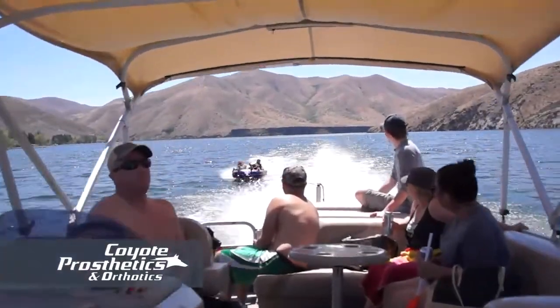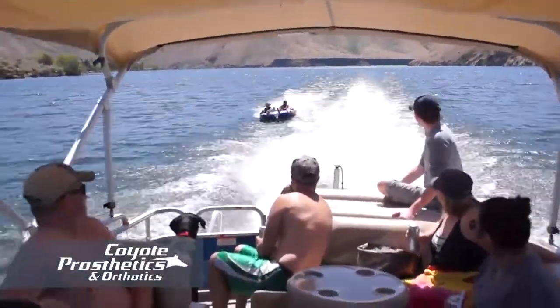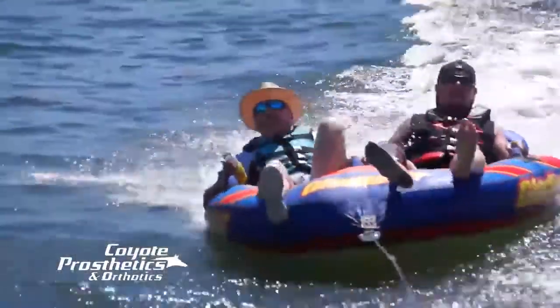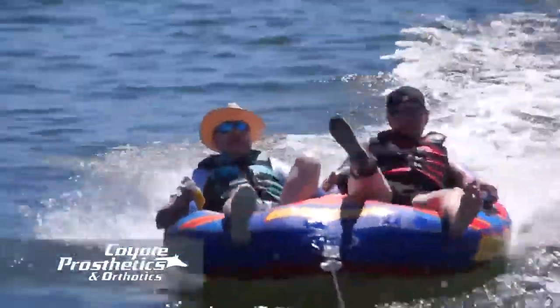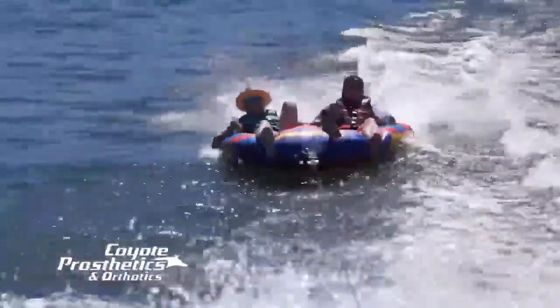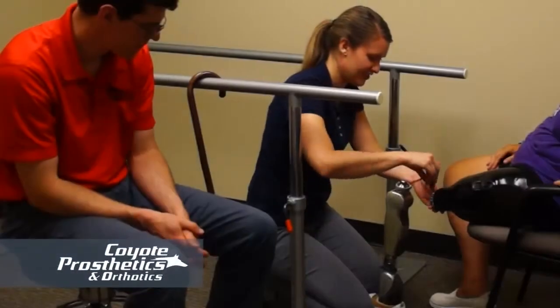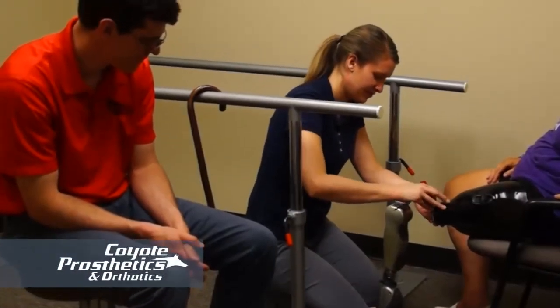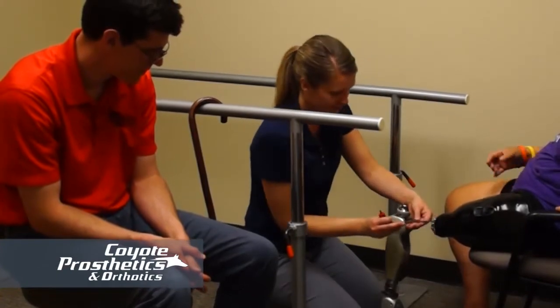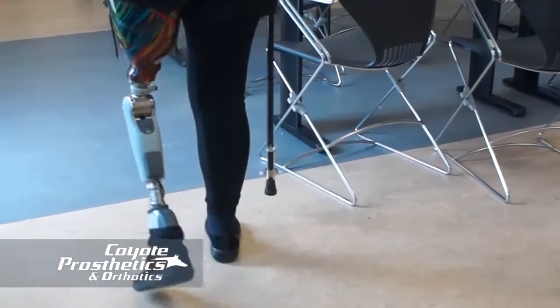As a general rule, you don't want to get your prosthetic wet. That'll make it wear faster, deteriorate faster. There are special prosthetics that are made just for that, but as a general rule, you don't want to do that. If you do get it wet, dry it off right away. And as a big rule, any of your microprocessor parts, which are some of your knees and ankles, most likely you'll know if you have one, you really want to keep those away from water as a general rule.